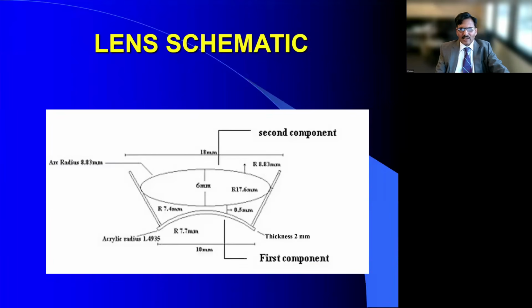But you have one other limitation here. You also want access to your ports without any intrusion or encumbrance from your lens. So there is some limitation of increasing the diameter of your lens. And the maximum we can do is only 18 millimeters, as you can see here. And that is the second component. It has to be airtight because otherwise you'll get temperature change and condensation, which will also compromise the quality of what you're seeing.